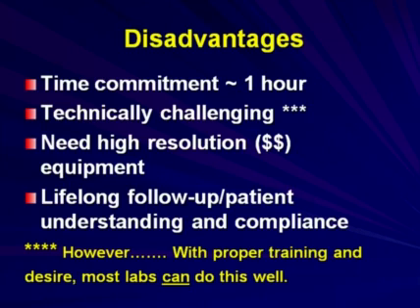The disadvantages is that it does take a time commitment. It usually takes about an hour or so to do these studies thoroughly. It is a technically challenging study. However, with proper training and desire, most labs or facilities can do this well. You do need high resolution or the more expensive type of equipment because you need something with very robust spectral and color Doppler. But the hardest thing, I think, and the biggest disadvantage is making patients understand that they are committing to lifelong follow-up and compliance with that follow-up so that we can identify any complications that may occur over time. Thank you.